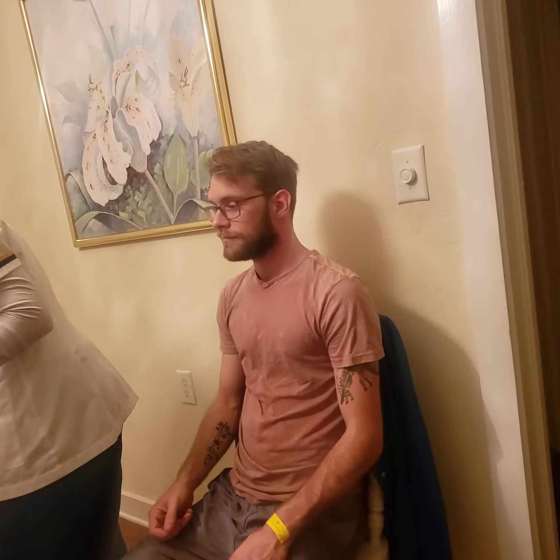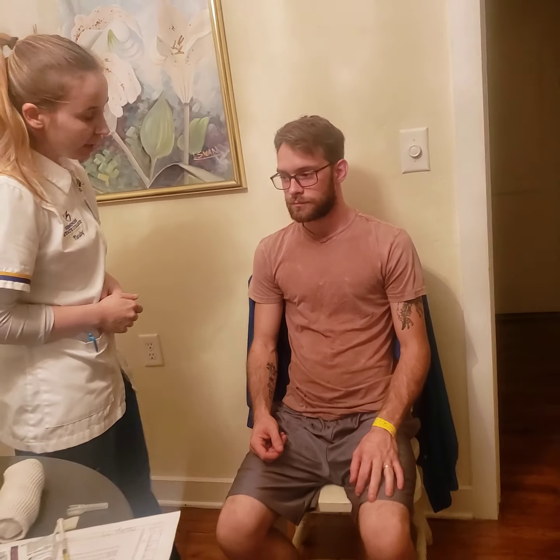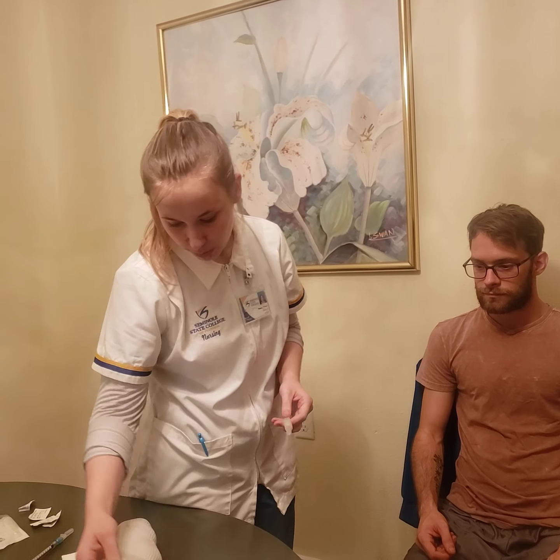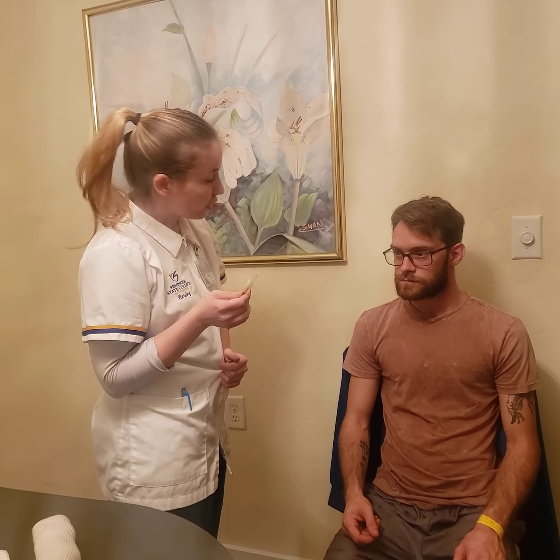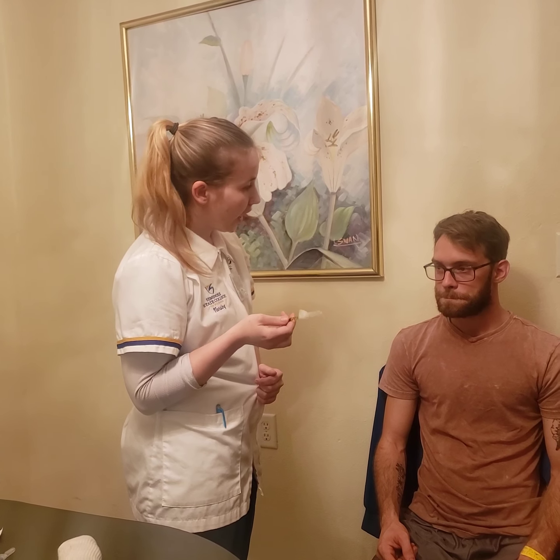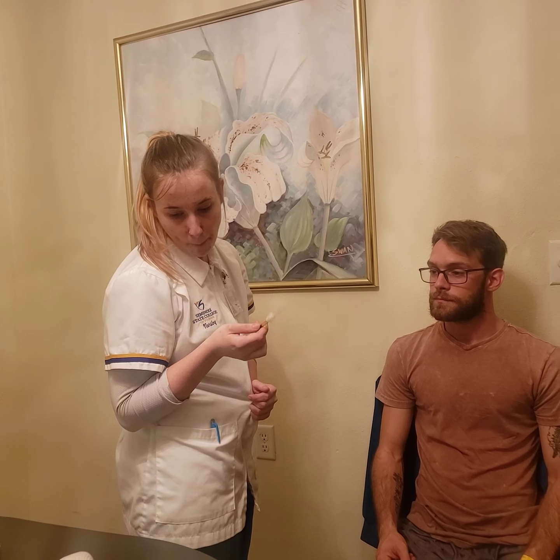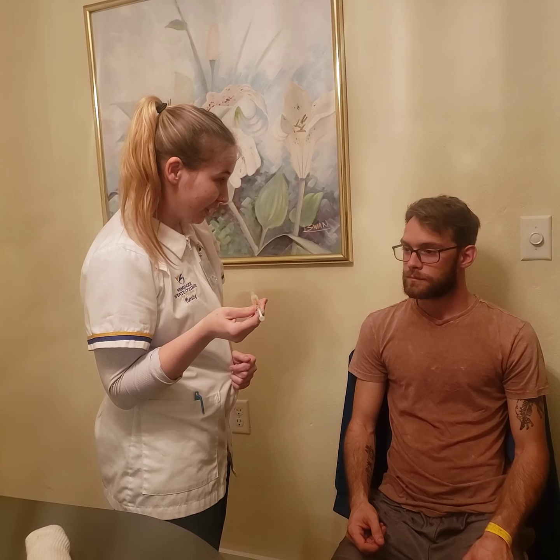All right, that's good. So now we're gonna be doing your second injection. It's gonna be your injection for your anemia. I'm gonna be giving you, Ms. Pawlowski, B12. I'm gonna be giving you 500 micrograms, which is a half of a milliliter, 0.5 milliliters today, subcutaneously.